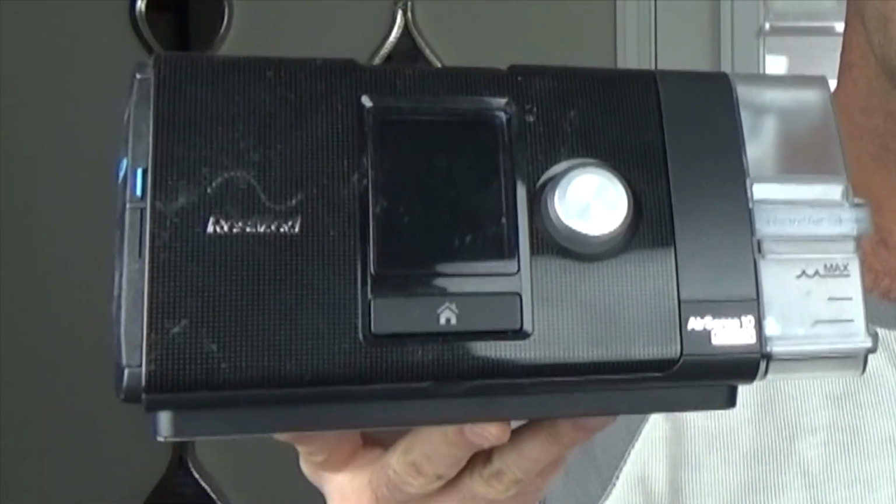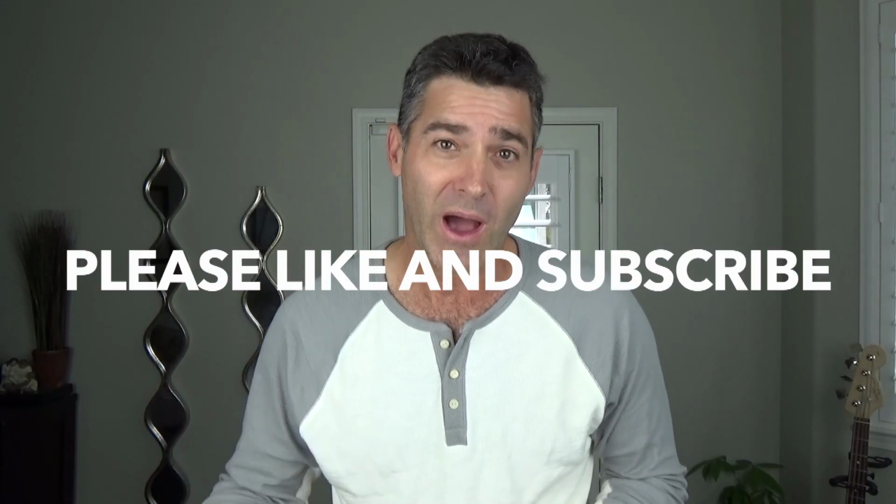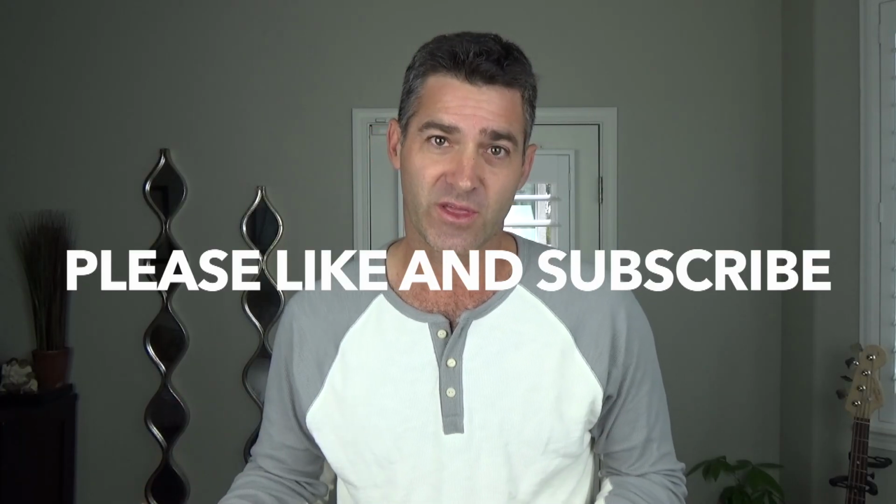Now, the purpose of this video is to do kind of a refresh of a video I've done in the past about the ResMed Airsense 10 APAP machine. I want to get into more than just the settings. How do you get into the Clinicians menu? I'm going to show you how to get in there, but I'm also going to show you some really important things about the settings within the Autoset.